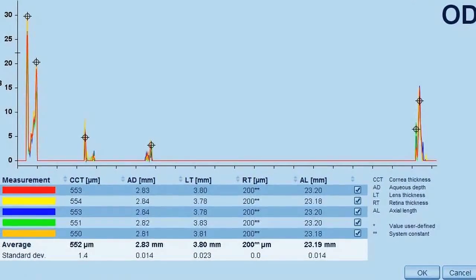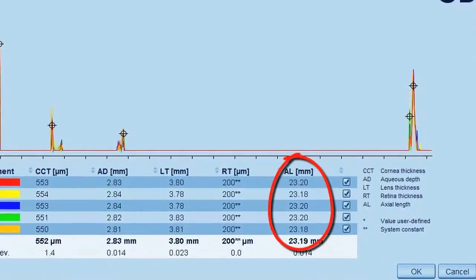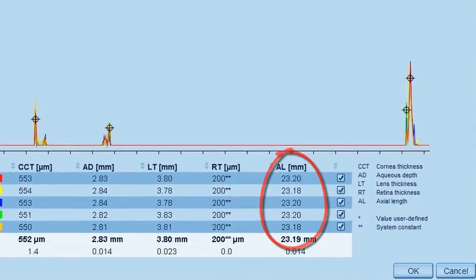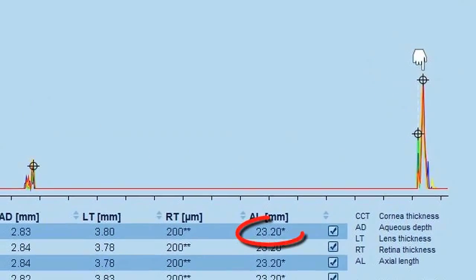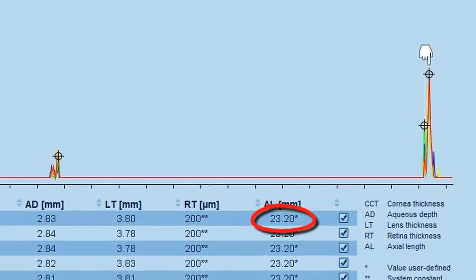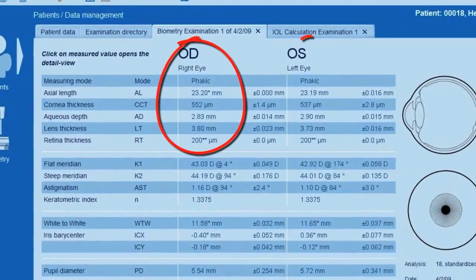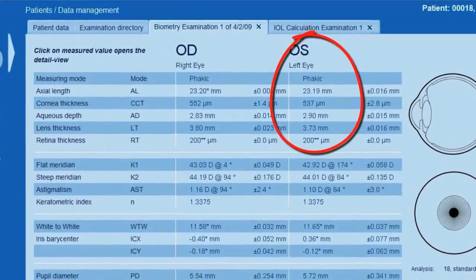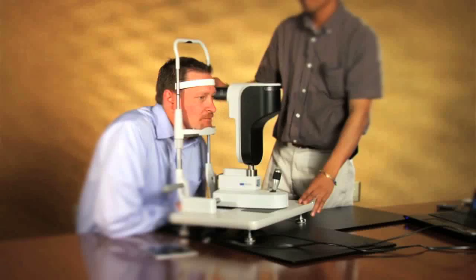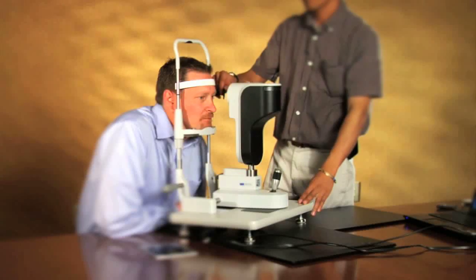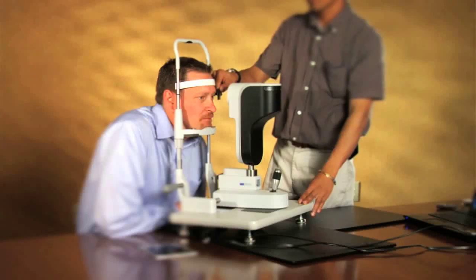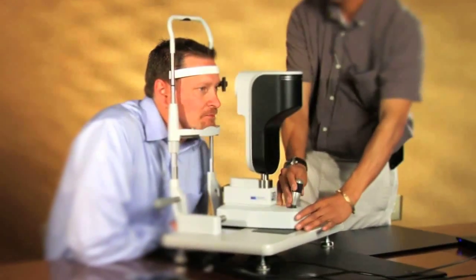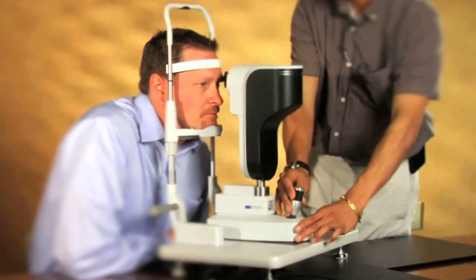Axial length is a key measurement with significant improvements in the LenStar system. It is a very key component of two-variable formulas and new generation formulas such as Holladay 2 and Haigis. It has to be precise.